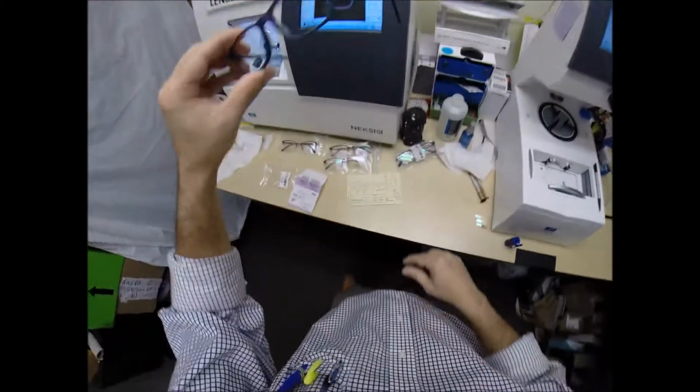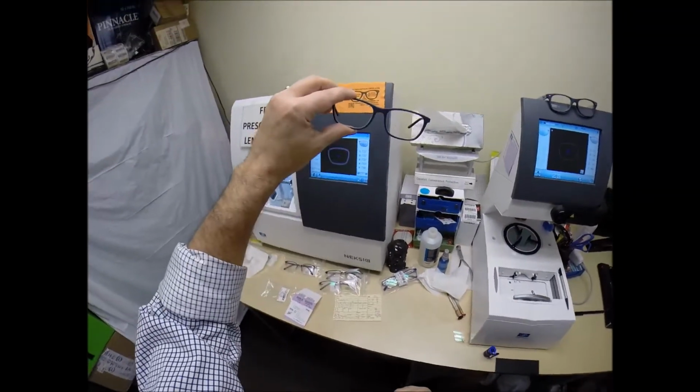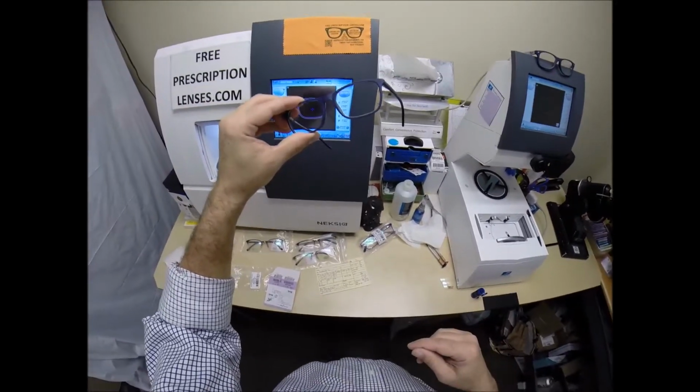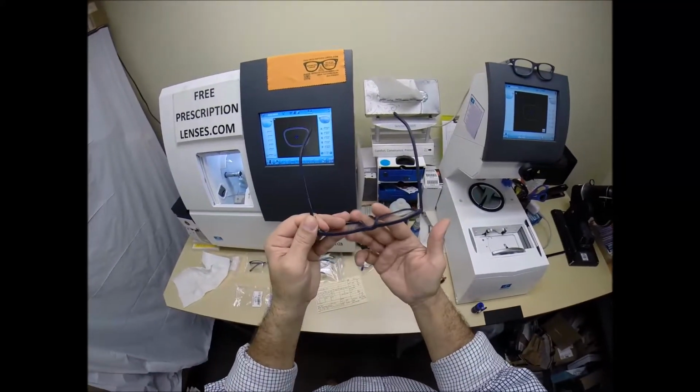So just stop in your local place there in Knoxville where you had your exam and just tell them if it's too loose or too tight or high on one side. It only takes about 30 seconds to a minute to adjust a pair of glasses perfectly. But I'm going to get them in standard alignment first, also known as a 3-point stance. So 3 points are 1, 2, and the bottom of the frame being 3.